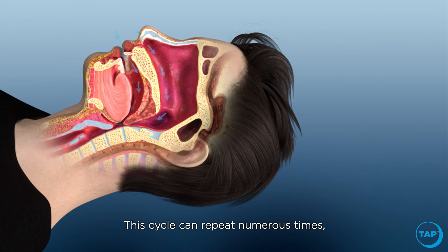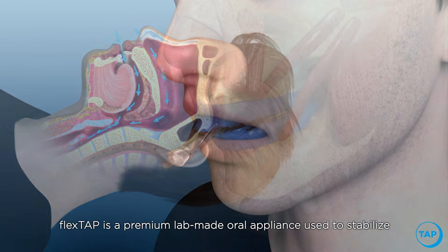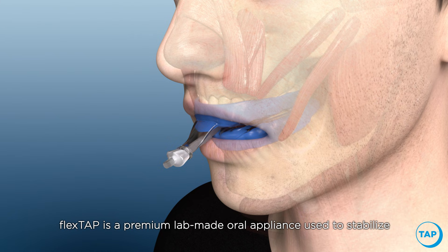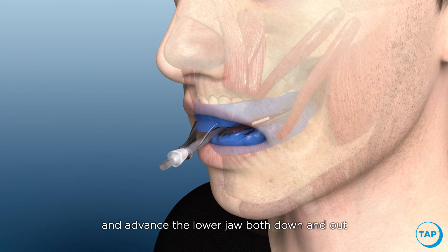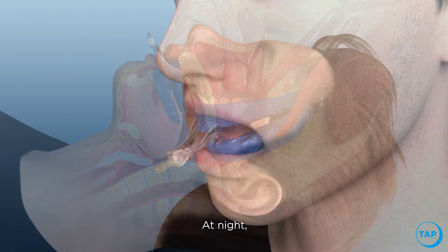This cycle can repeat numerous times, hindering deep sleep. Flex Tap is a premium lab-made oral appliance used to stabilize and advance the lower jaw both down and out, which opens the airway and prevents sleep apnea at night.